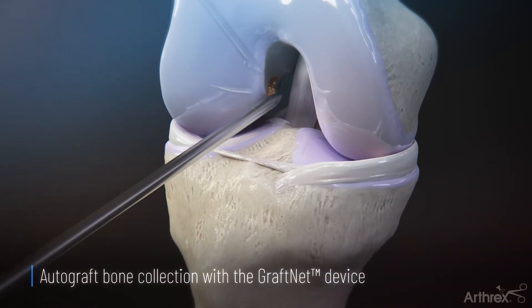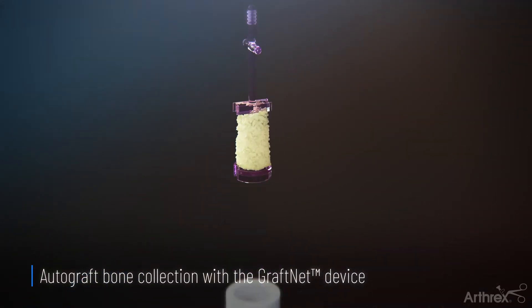Tibial and femoral tunnels are drilled, with the bone debris being collected by the GraftNet device.